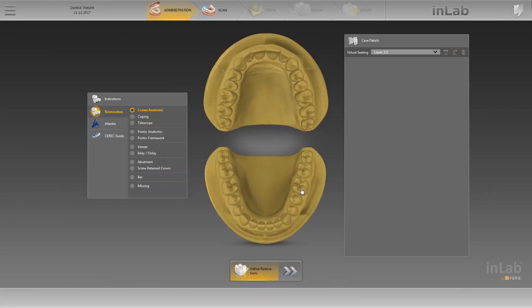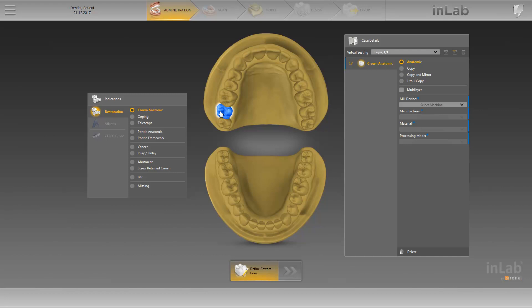First, we will create three adjacent anatomic crowns in the odontogram. We will click on position 1-7, then on position 1-6, and finally on position 1-5. As we have selected the three positions in the odontogram one after the other, they are automatically grouped together, but are not yet defined as a bridge. At the moment, the in-lab software treats them as three single-tooth restorations.